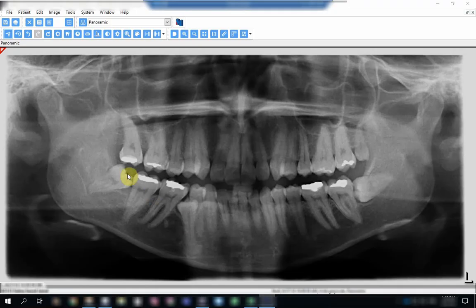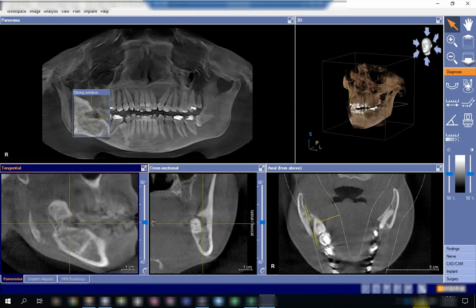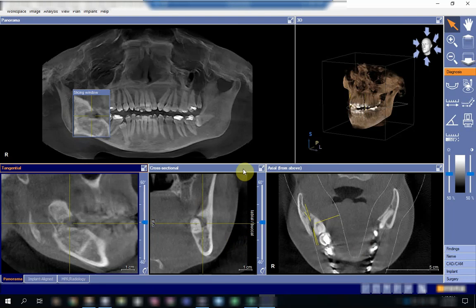If we go back to the coronal view and to the normal OPG, you don't clearly see this area. There is a radiolucency visible, but the advantage of CBCT is that there is no superimposition of structures, so you will be able to view hidden pathologies or structures that are otherwise masked by the 2D view.